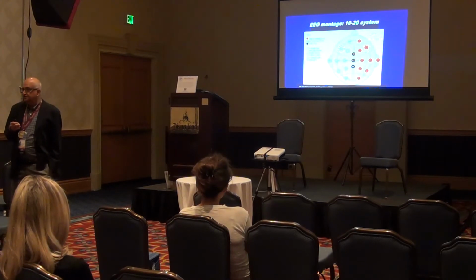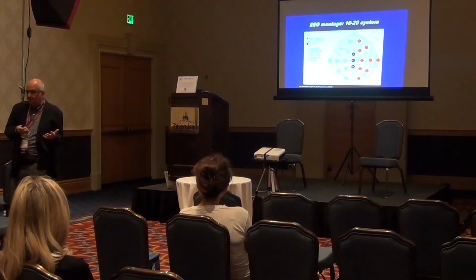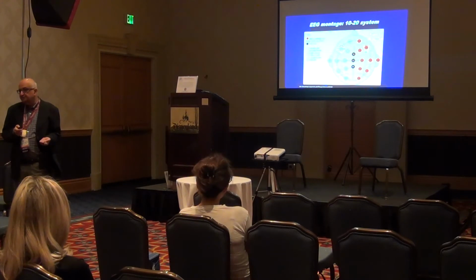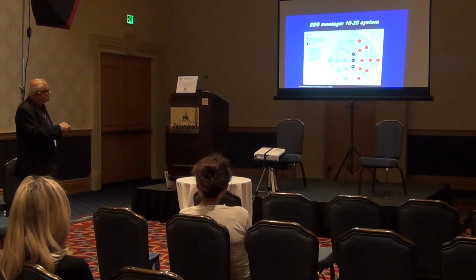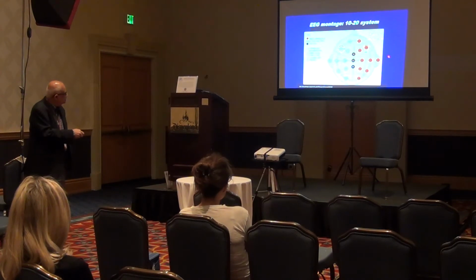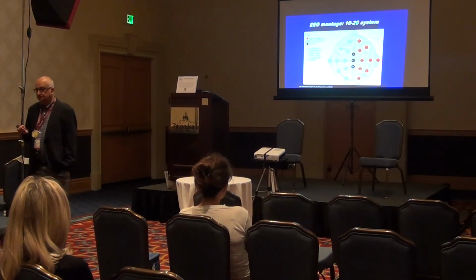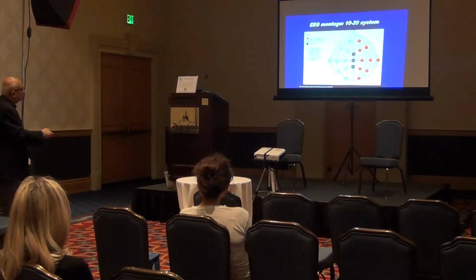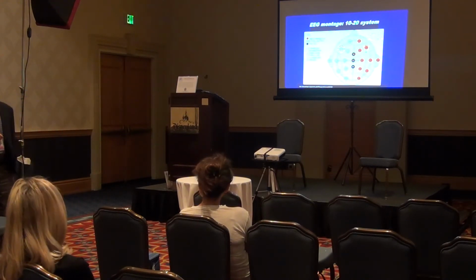We don't need to go into the technical aspects of why we do this, but just know that when they're reading your EEG, at the flick of a switch, they can change the connectivity to go differently. They can go from A1 to T3 to C3 to CZ to C4, T4, A2, right? When they do this way, they call it a coronal montage. Why do they say coronal? It's like the crown, right? When we connect things this way and this way, to some people it looks like a banana.